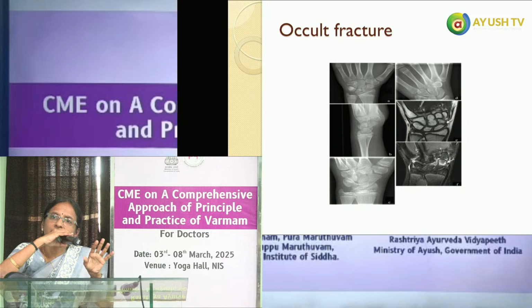Again, I told you femur neck and scaphoid. For the scaphoid, first they take an AP view. Carpal bones are seen, but all the carpal bones look normal. Second, they have taken a lateral view. So, an orthogonal view, as I told you. Sometimes if we change the angle, some fractures can be picked up. But in the lateral view the fracture was not picked up.